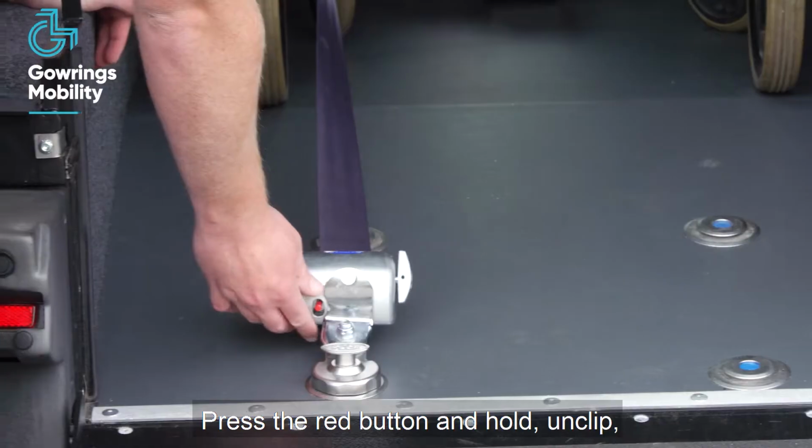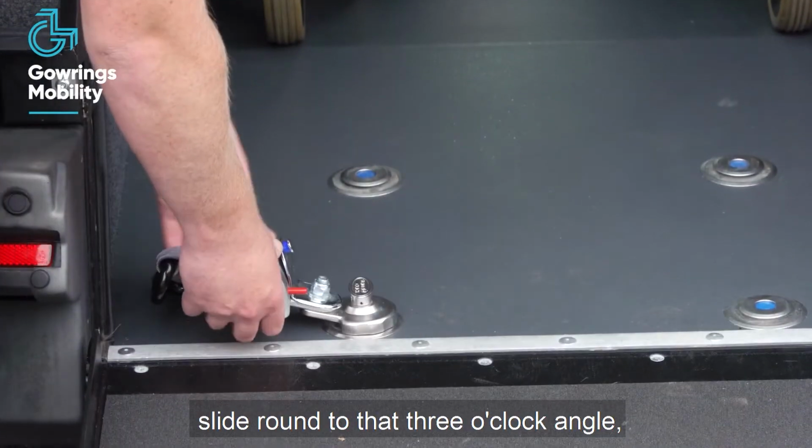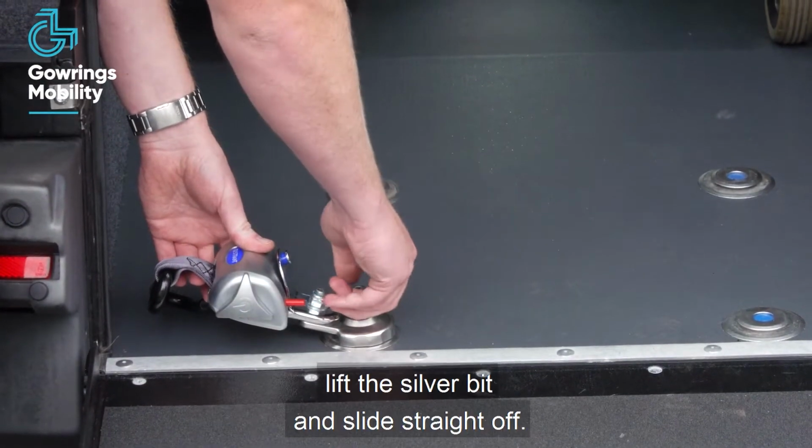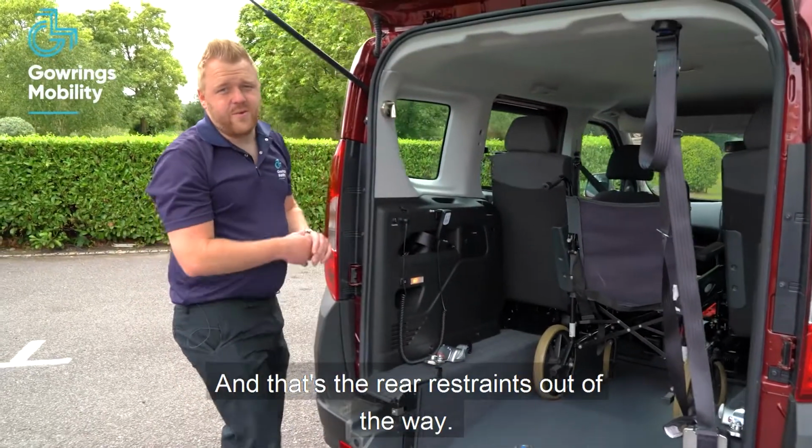So press the red button and hold, unclip, slide round to that 3 o'clock angle, lift the silver bit and slide straight off, and that's the rear restraints out of the way.